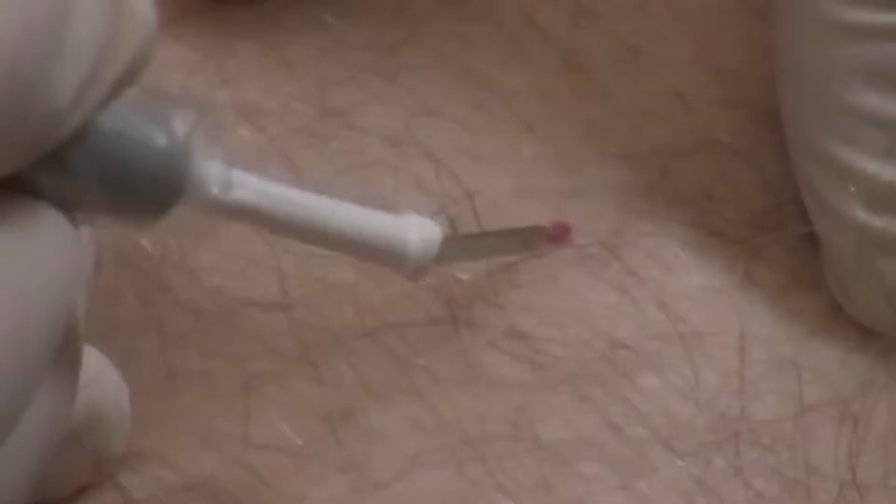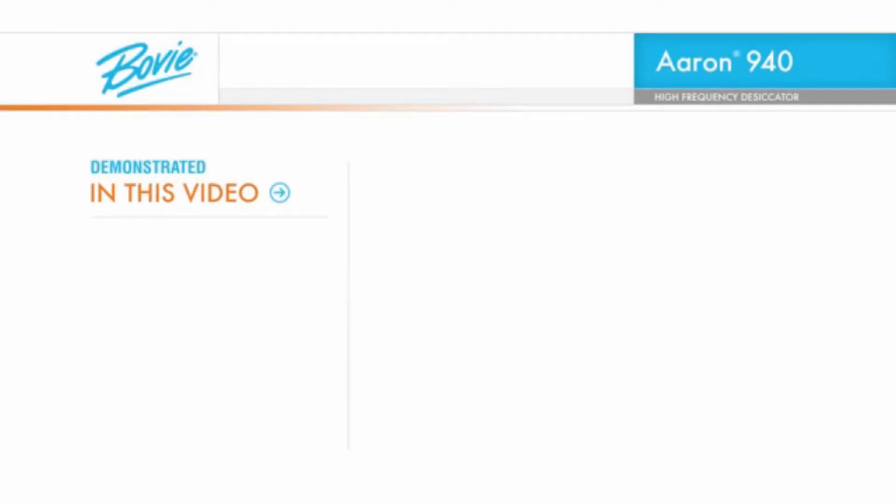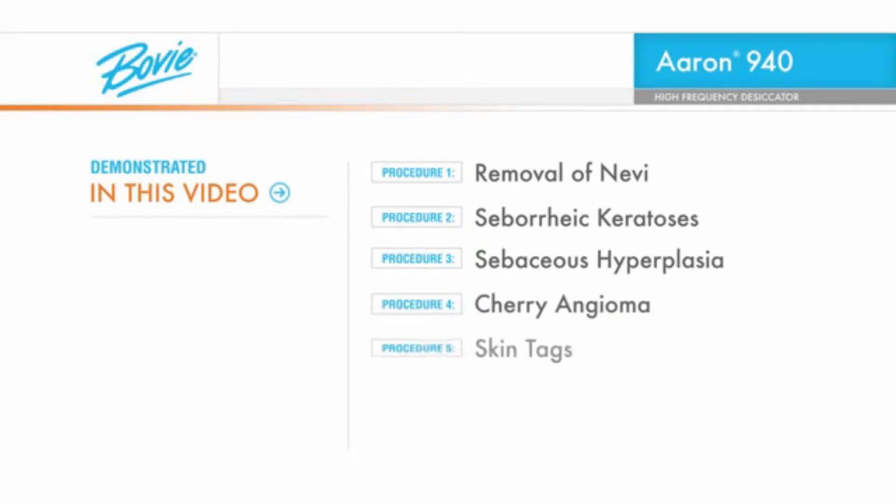This video will show you the new level of flexibility and control you'll enjoy while performing the removal of nevi, seborrheic keratosis, sebaceous hyperplasia, cherry angioma, skin tags, telangiectasia, and unwanted hair.